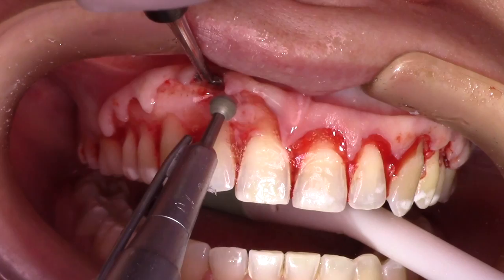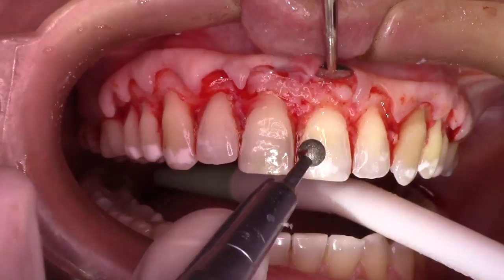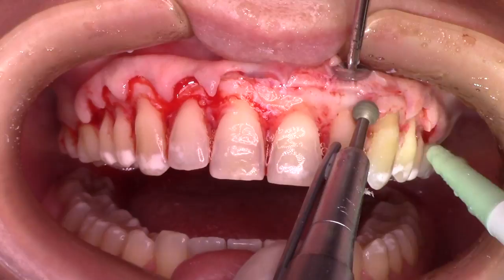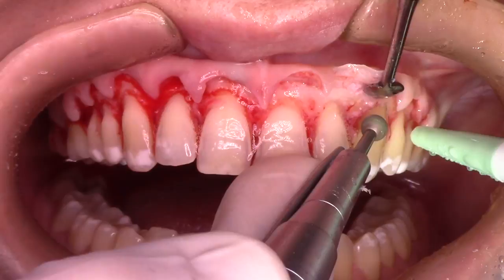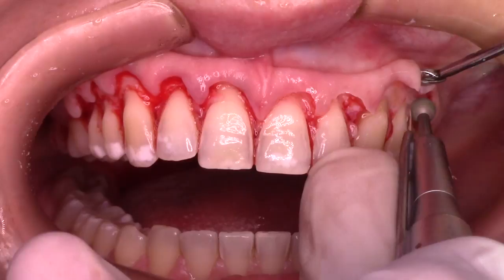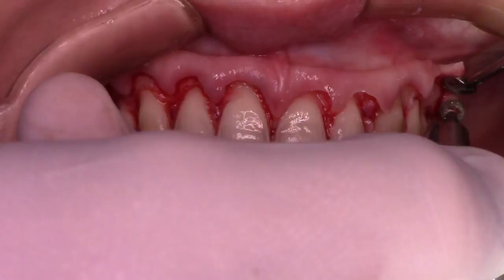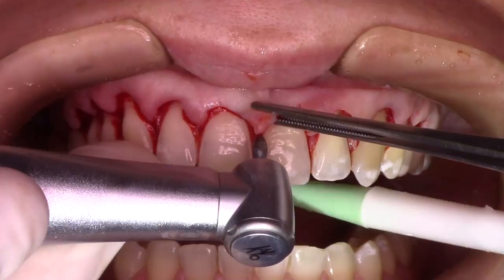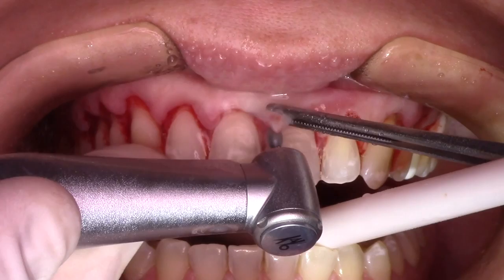When you finish the bone contouring and establish this new biological width for the patient, you need to check the fitting of the flap. Not uncommonly, you're going to notice a different thickness in the papilla area than in the cervical margin of your flap. That happens because beveling is easier to do at the cervical margin than in the papilla area. So for the thicker papilla, you can reduce its volume by holding the papilla with a plier and wearing out the inside — the connective part of the papilla — with a fine diamond bur, as you can see in this part of the video.